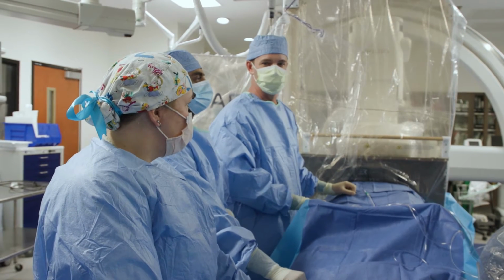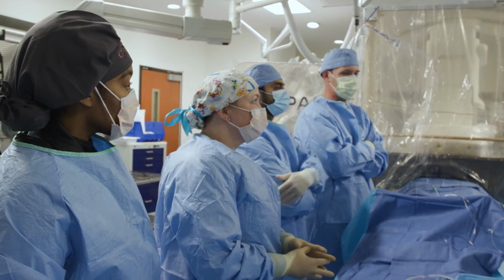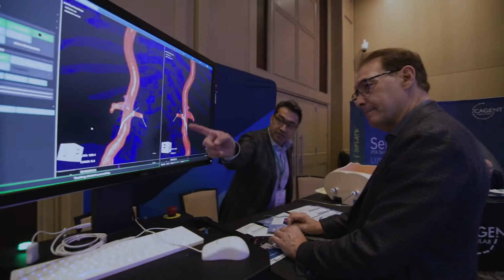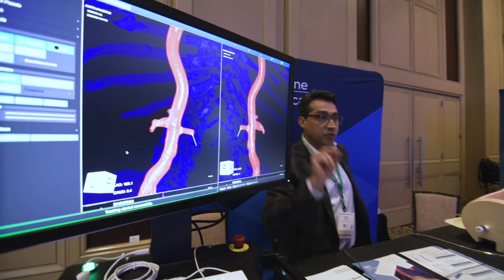It's really an unusual thing to get used to, not wearing lead for the case. You always feel like you forgot your lead midway through the case, but it is pretty nice from the perspective of your back pain and comfort during the case. The tip's the direction. That will be where the device has stopped, and it's just pointing you in the direction that you're going.